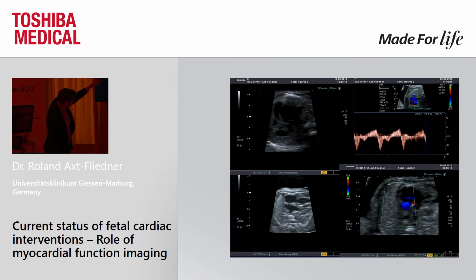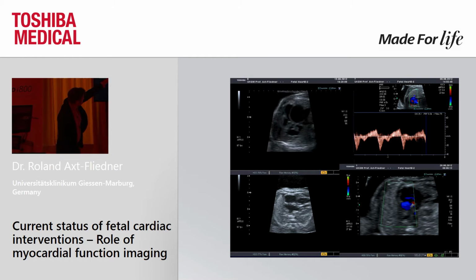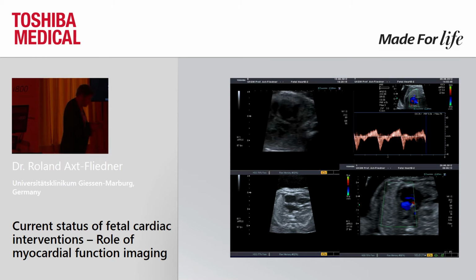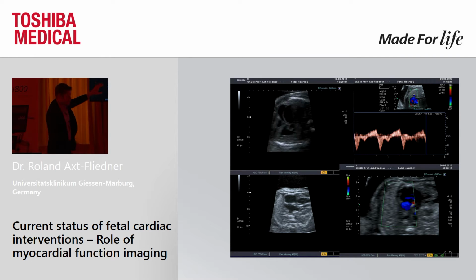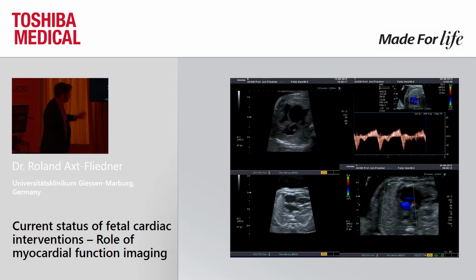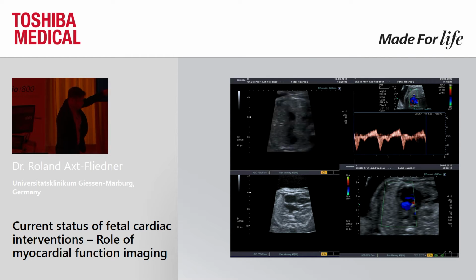You see here a small left ventricle with an abnormal mitral valve, and you see here, because the pointer is not working on this screen, that the foramen ovale is sealed and bulged into the right atrium, and you see here the abnormal pulmonary vein spectrum, which you would expect in those cases.